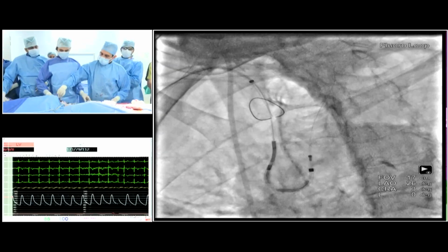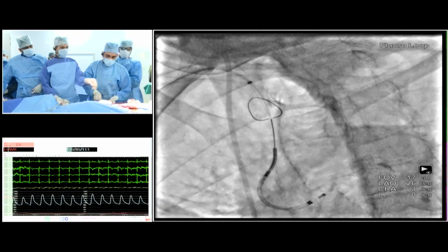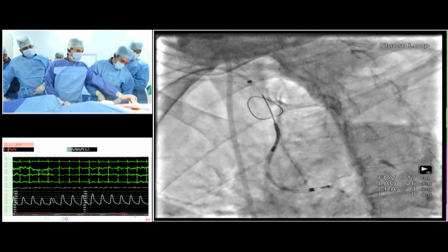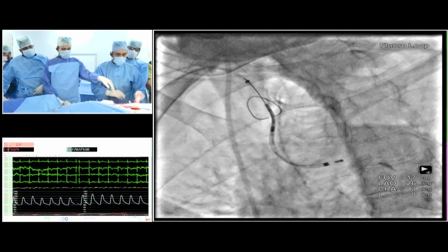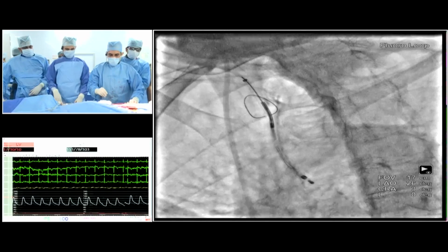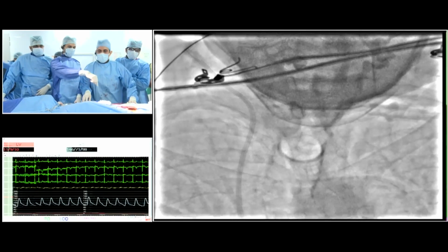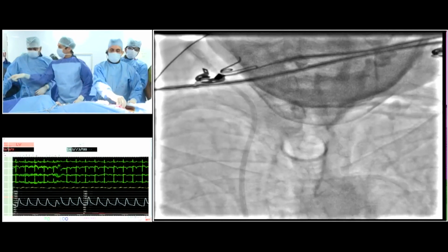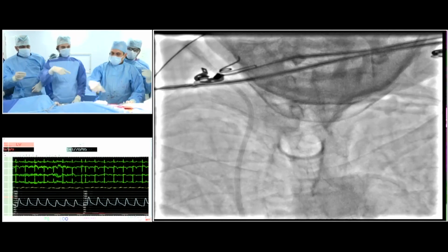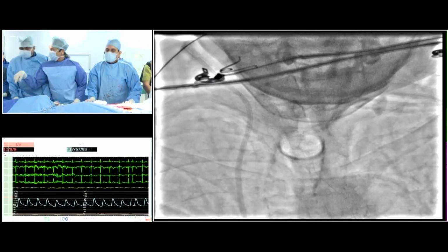I think it's important to collect some durability data, right? There are lots of patients that were done. Ravinder talked about the first patient done 6 years ago. I think that will give comfort and confidence because we know about the durability of Evolut and we know about the durability of Sapien valves. So it is critical to accumulate data about the durability of this valve.